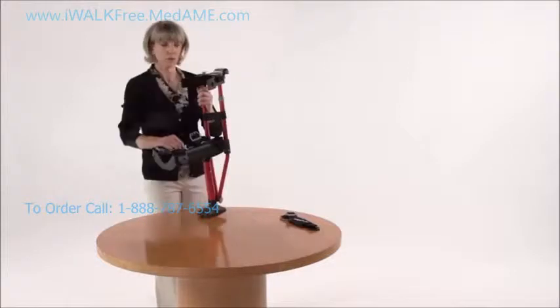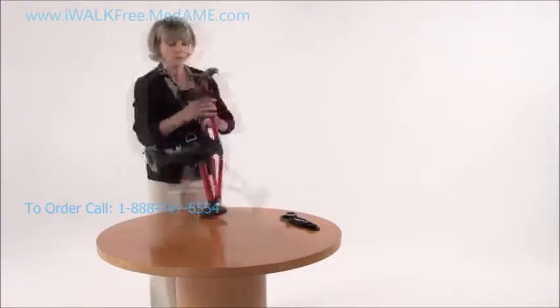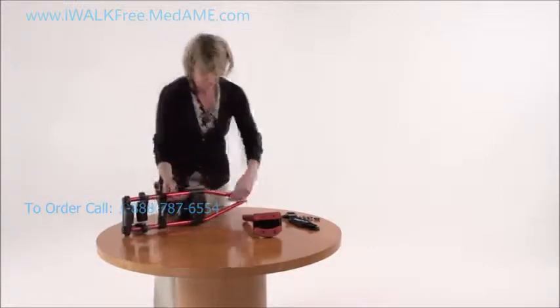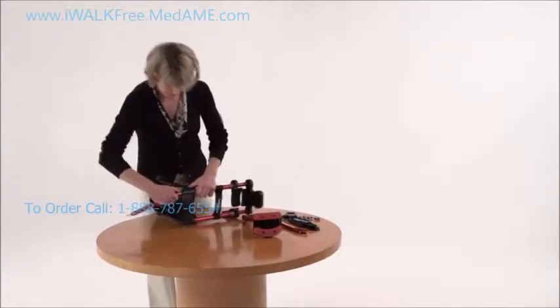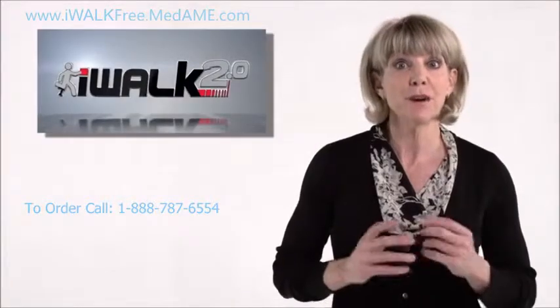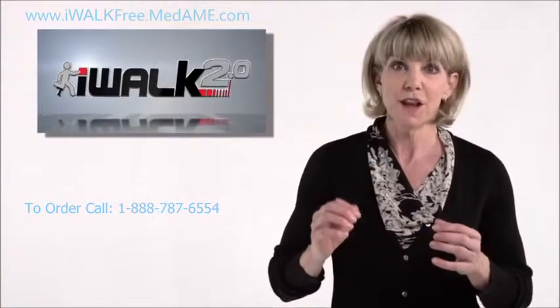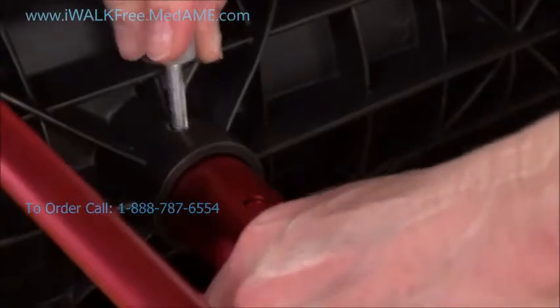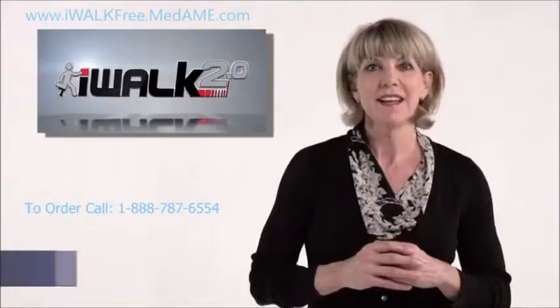That's all there is to it — your iWalk is assembled! Keep in mind that if you ever need to disassemble your iWalk, say to fit it into an airplane's overhead storage bin, taking it apart is pretty much the reverse of putting it together — quick and easy. If you have difficulty pressing the spring heads, the iWalk has conveniently provided a tool to assist you: just remove the bolt and use it to press down the spring heads.